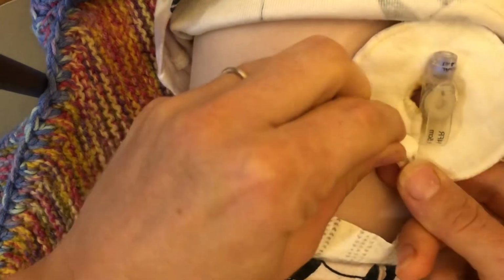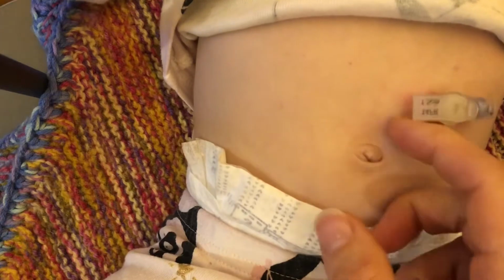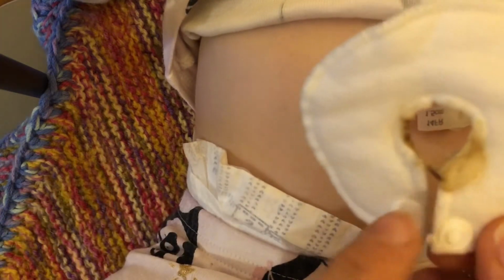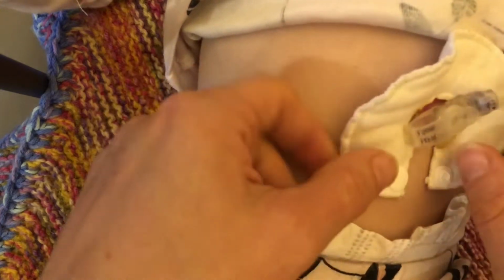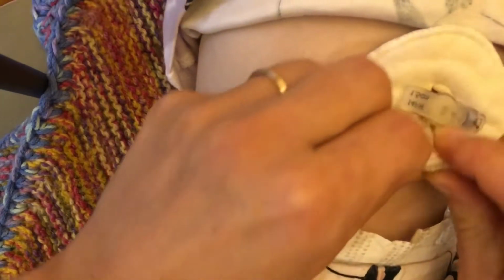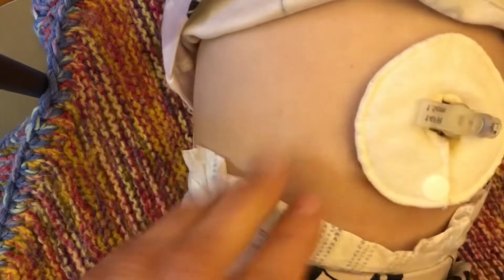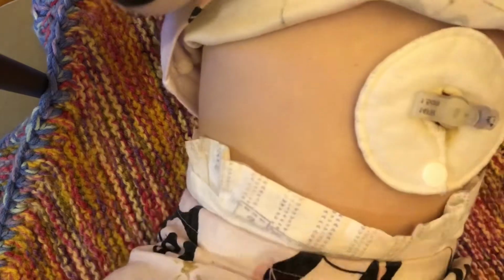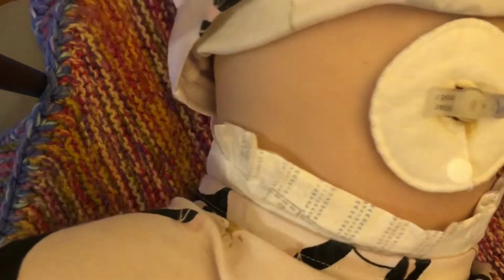So we always have a little cover over her button, but this is what it looks like without it. The cover just helps, she has a lot of leakage. Sorry, that's kind of gross. But that's Patricia. She always has a lot of granulation, so we keep the cover to kind of catch the granulation, and it helps it just stick where it is. So here's your book, honey.